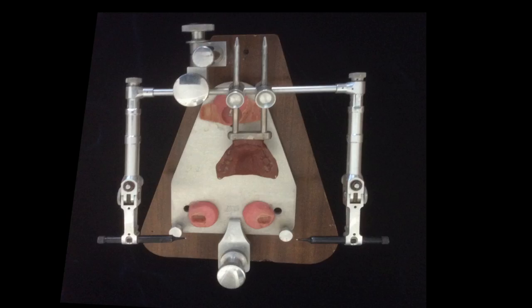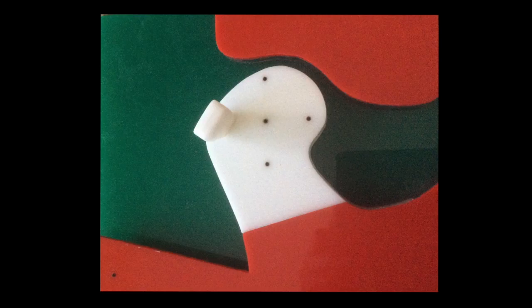It only takes a few minutes to locate the real axis, and it is so very much worthwhile. He had a series of slides on where the theoretical arbitrary axis was supposed to be and where it really was, and they were often at least a quarter of an inch apart. His model is mathematically accurate to demonstrate the error which occurs when there is a quarter of an inch of error between the real axis and the face-bow transfer from an earbow.